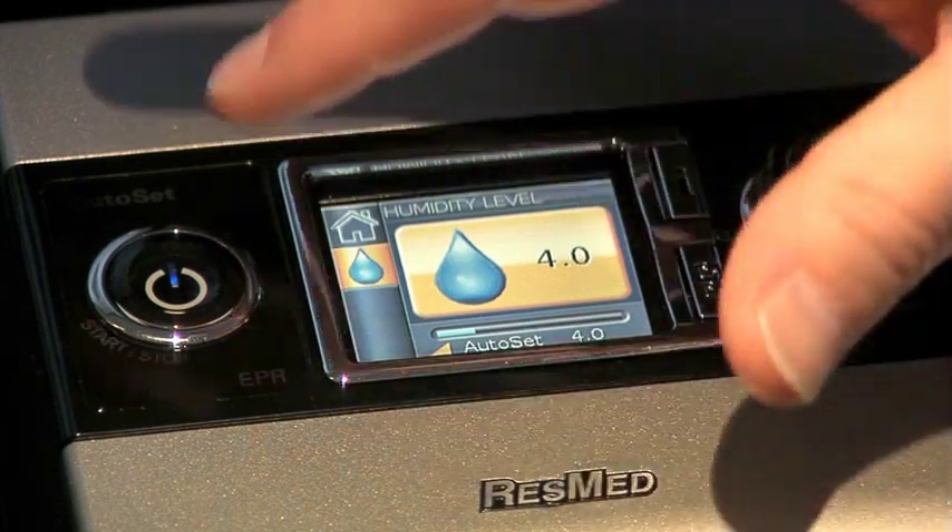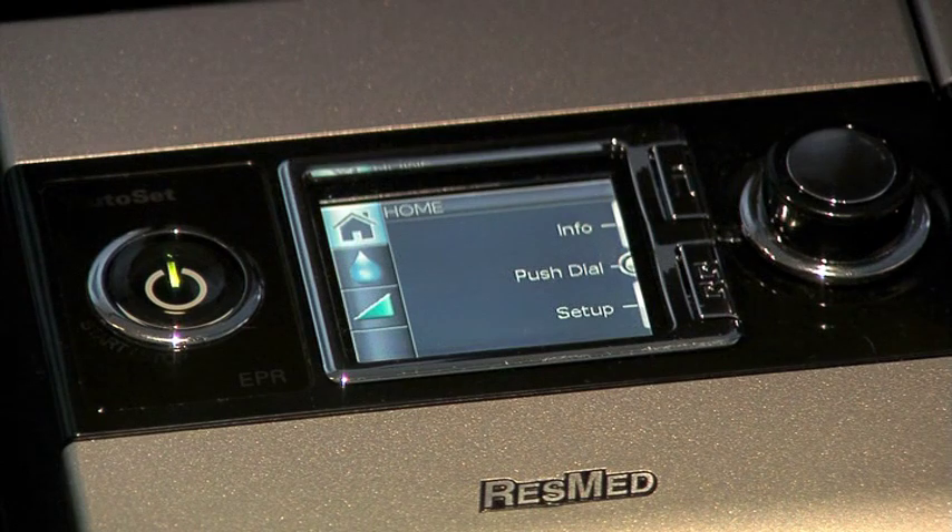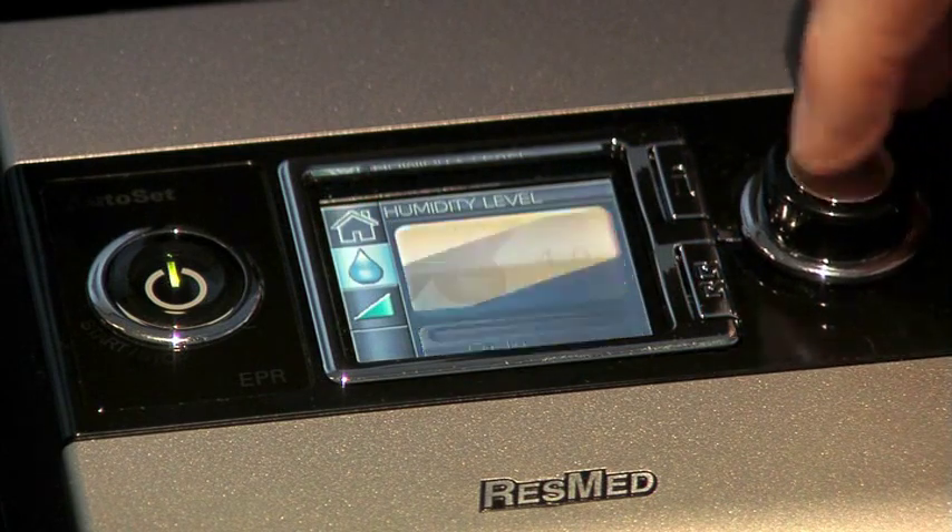Hi. One of the first things you'll realize is that the interface was designed to be intuitive, so that adjusting settings and customizing comfort levels is all very easy. And the large color LCD display makes it easy to see what you're doing.